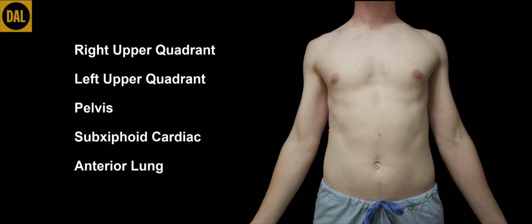Each of the views demonstrated in this video are outlined in more detail with their own video in this series. Please ensure you have practiced each of these views separately before combining them in the eFAST scan.